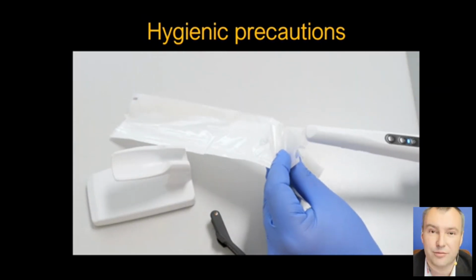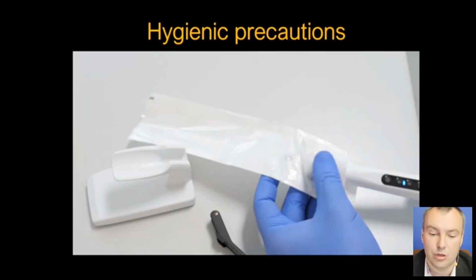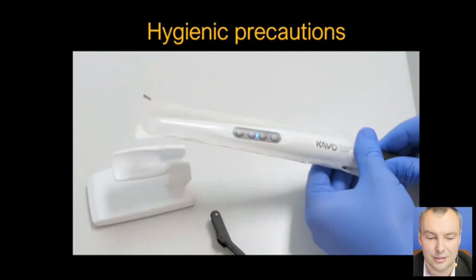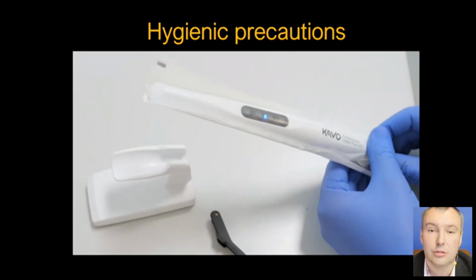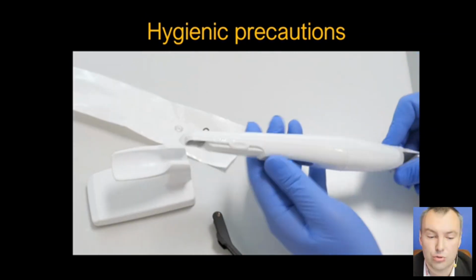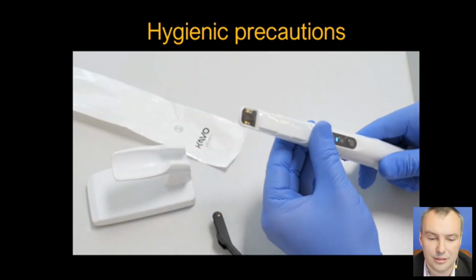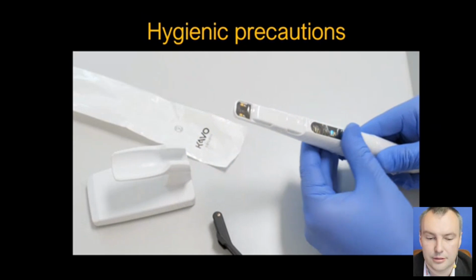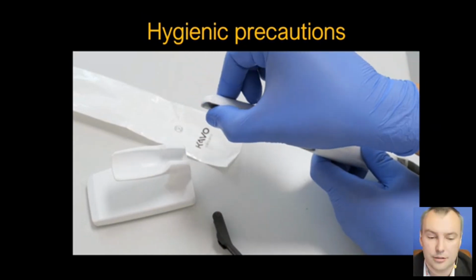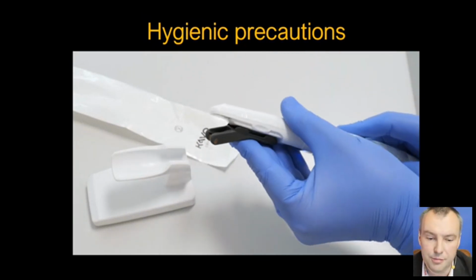If you can see the KaVo logo on DiagnoCam and on the plastic paper, then you know you put it in the right way. So please always do it like this. It's the easiest way. Remember to get rid of some air from the round camera place, and that's it. After putting it in, you can mount a transillumination tip on the DiagnoCam.